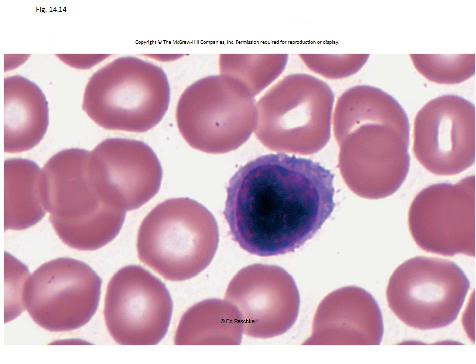So this is the better picture of a lymphocyte. The thing about a lymphocyte is that it ends up looking like one big purple dot, because it is almost entirely one big nucleus. It is a nucleus with a light blue halo around it. That's kind of what it looks like under the microscope.